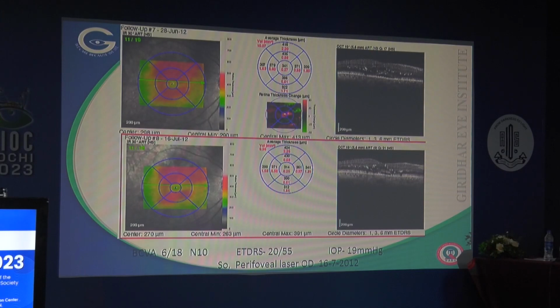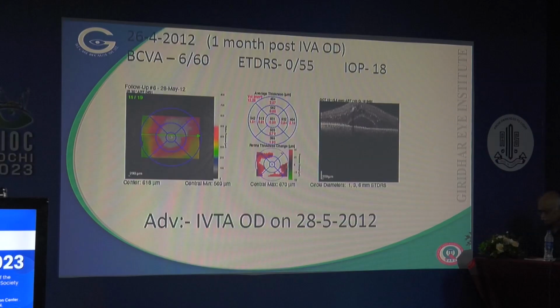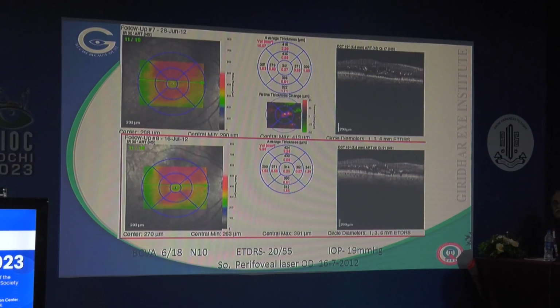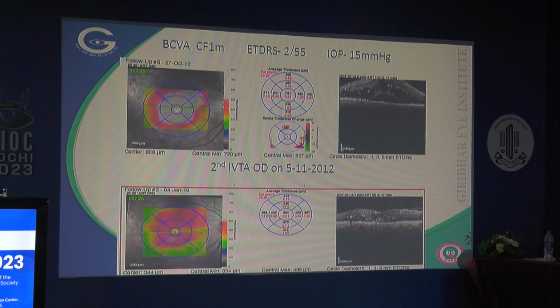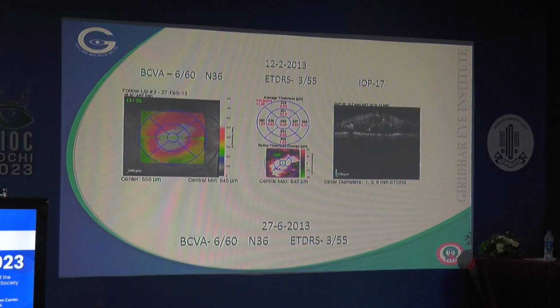And if you see the initial picture, now if you see this sort of picture, you know that these are patients who are likely to have a lot of microaneurysms, and therefore you do the fluorescein angiography. And after the edema resolves, let's give perifoveal laser photocoagulation to the microaneurysms. This is a must, especially in patients who have got circinates. They do extremely well with laser photocoagulation. But unfortunately, this patient again had a recurrence and again received 1 more shot of triamcinolone, and again we did the fluorescein angiography, and residual microaneurysms were treated.